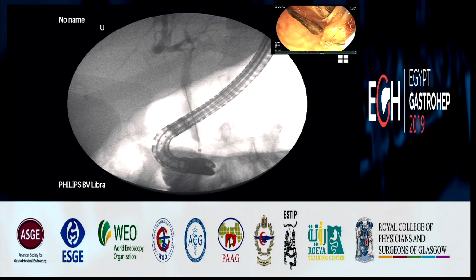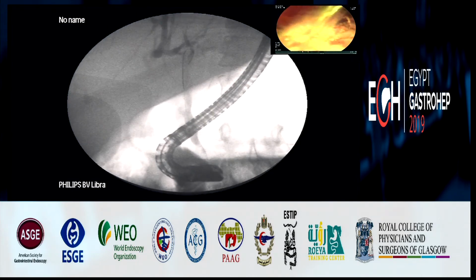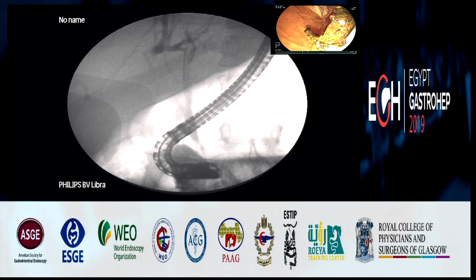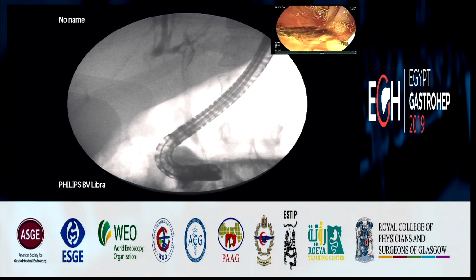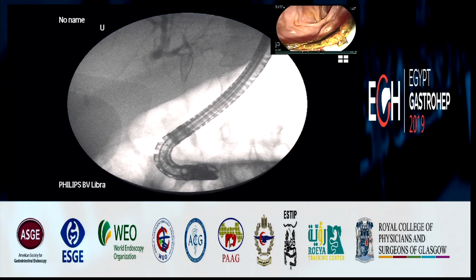So when you can leave it with the guide wire, you can have a final fluoro. So the emptying is good at the CBD, and you see the duodenum is full, and also the balloon passes very easily. So I wouldn't put any more stents, at least for the problem of the post-cholecystectomy stricture that you had. And on the intrahepatic, we have to see how she is without anything inside. So MRI. Okay? So we are finished here.